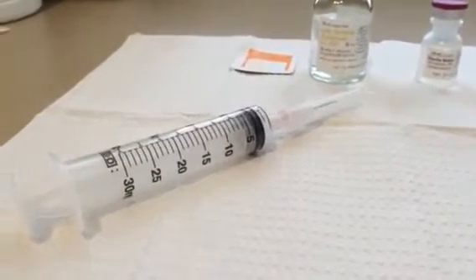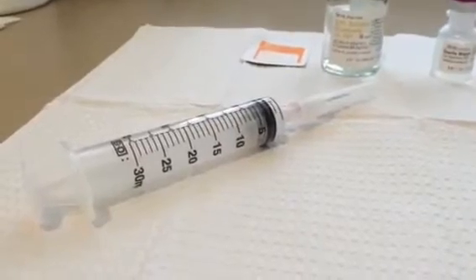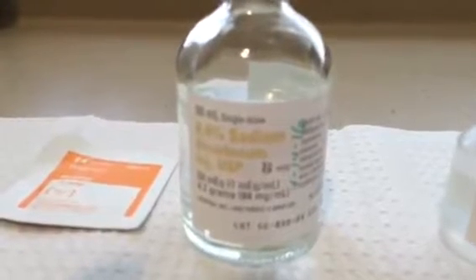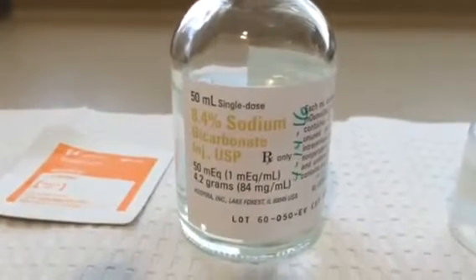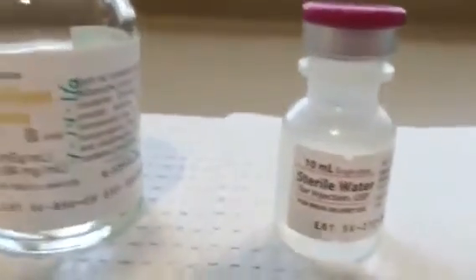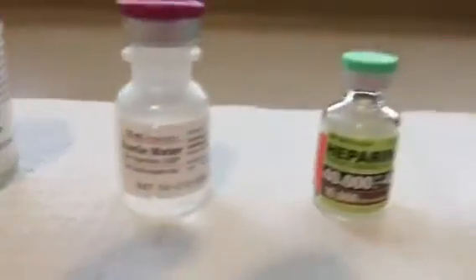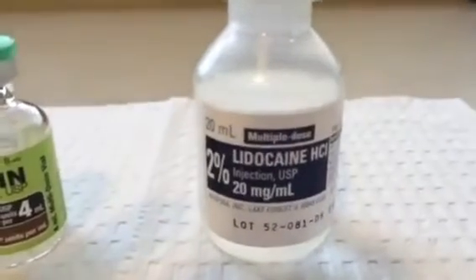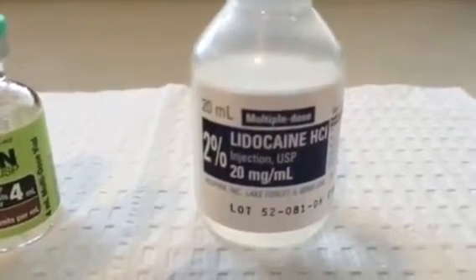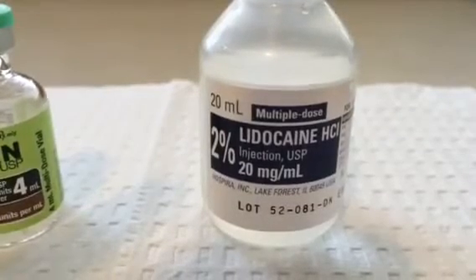In order to prepare a bladder instillation, the following items are needed: a 30 cc syringe with an 18 gauge needle, sodium bicarbonate as an 8.4% solution — we use 3 cc's of that — about 5 cc's of sterile water, 40,000 units of heparin, and 10 cc's of 2% lidocaine, which is 200 mg of lidocaine.